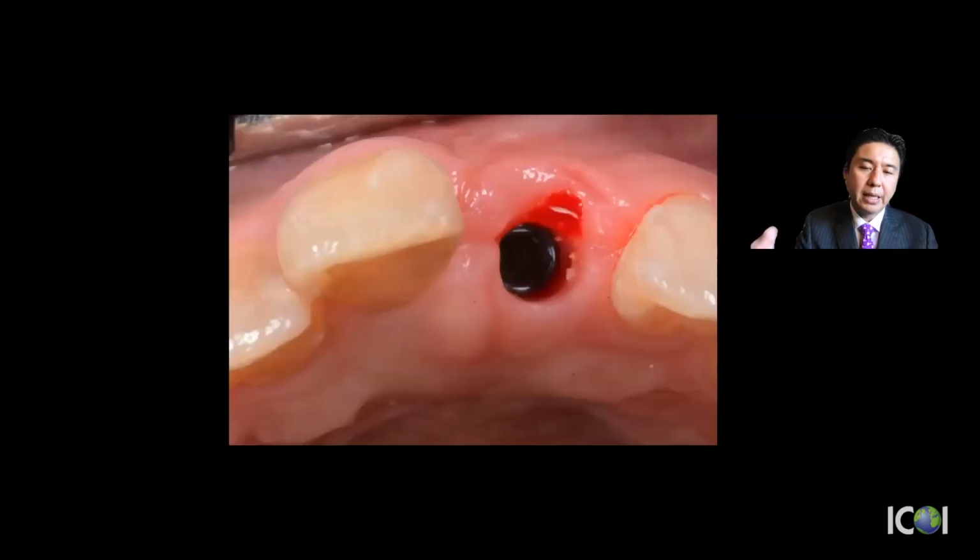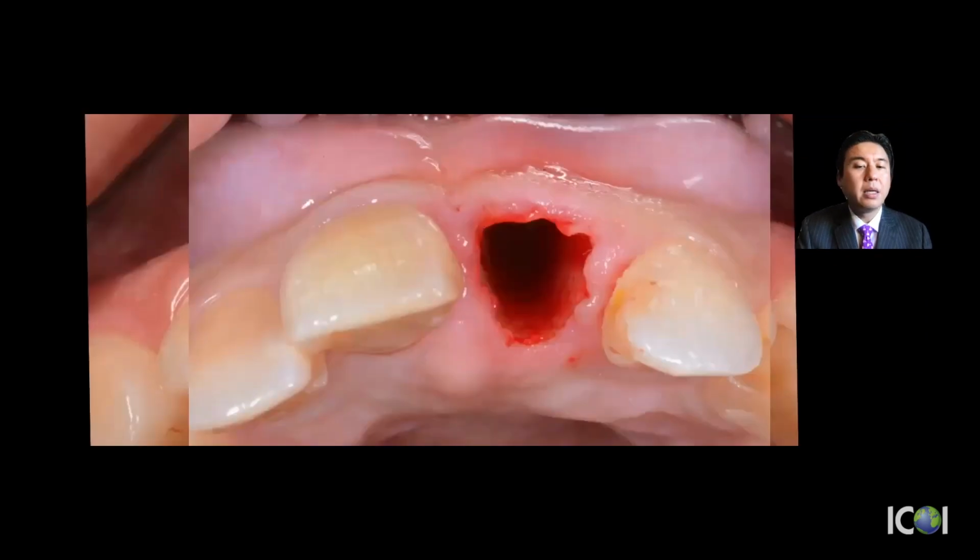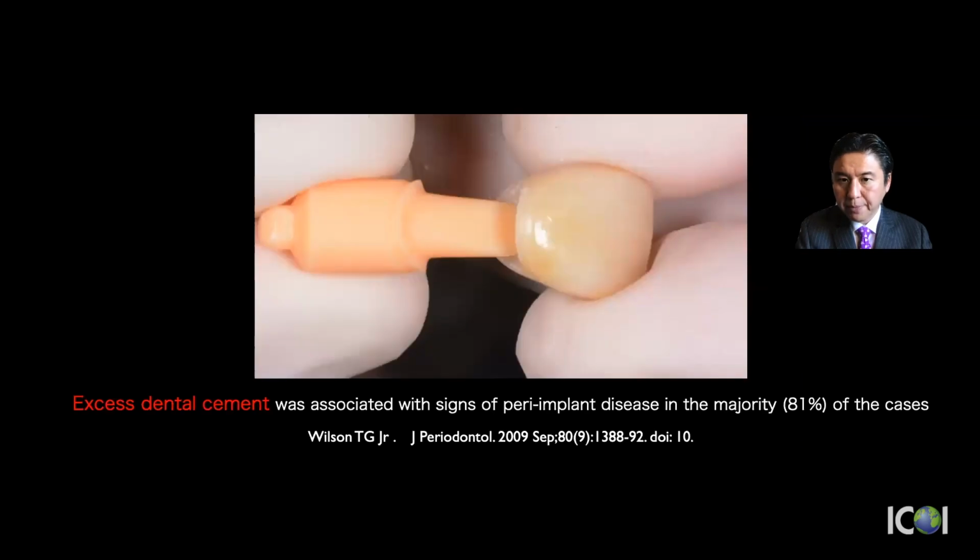So for the delivery, I remove the shell. You can see the bleeding and some biological particles captured in the soft tissue. And then I place it on the final abutment. This is the day of the extraction, the day of the surgery.